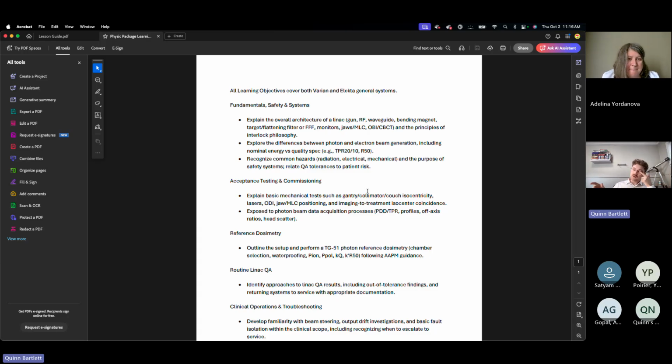So we went and scoured the Camp App website and some other programs' websites that produce the curriculums that they're teaching their students. And so we condensed that into a big list. We went through them all and then just kept the ones that we can cover in Simac.